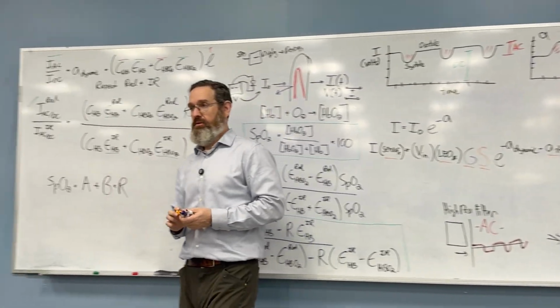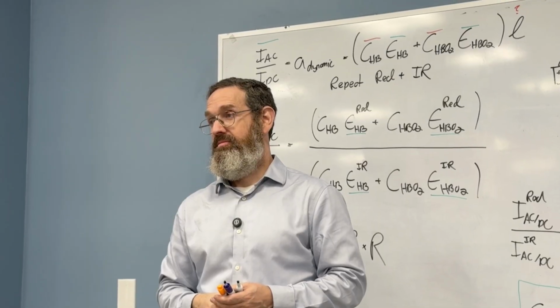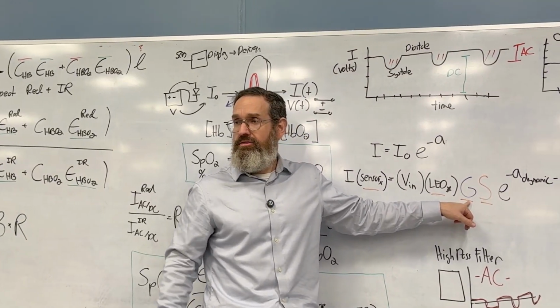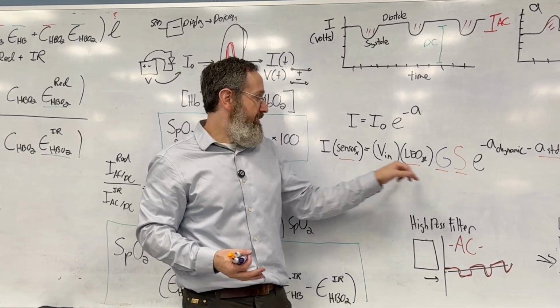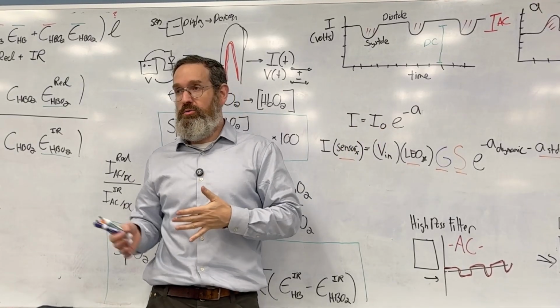Everything just fell apart. Do you see it? Do you feel that all this uncertainty makes it less reliable? Completely. What if this is 20 on me and 3 on Emily? And you don't even know. And then Mujtaba does it, and it's 5 on him. If we lose our equation, if we can't use Beer-Lambert, what are we talking about?